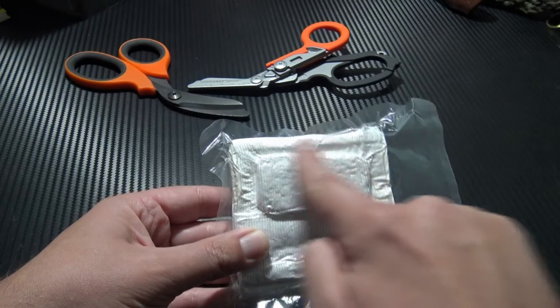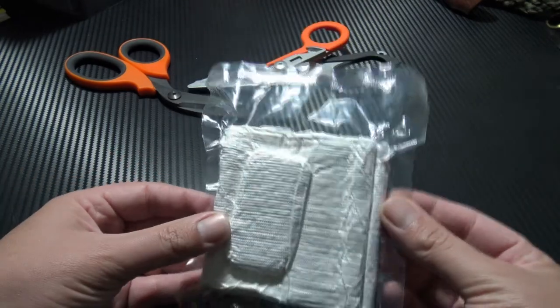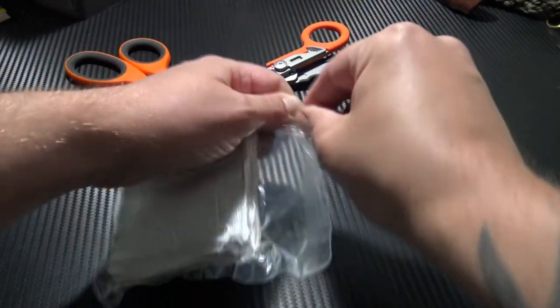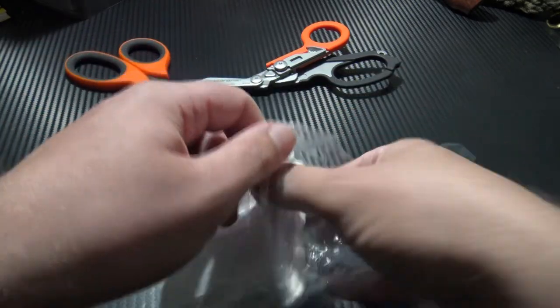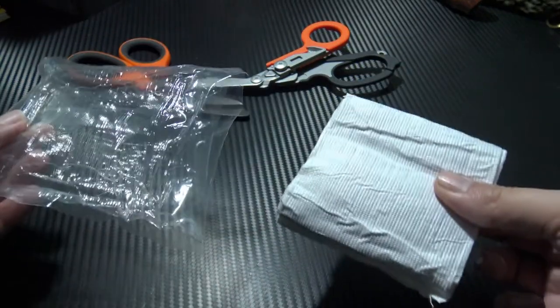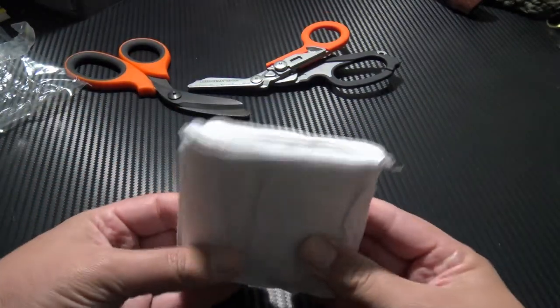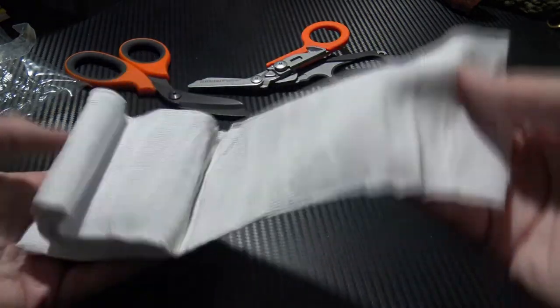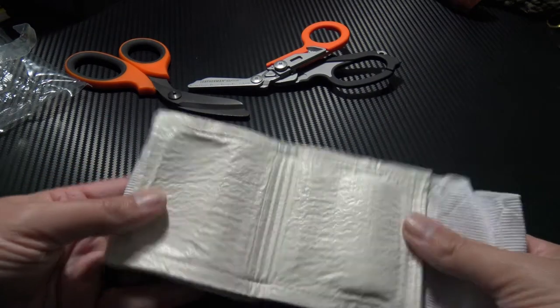You can see the pressure pillow there. To open: locate the tear notch, open it up and remove the dressing. Here we have the actual dressing itself. Locate the wound pad — this side goes towards the wound.